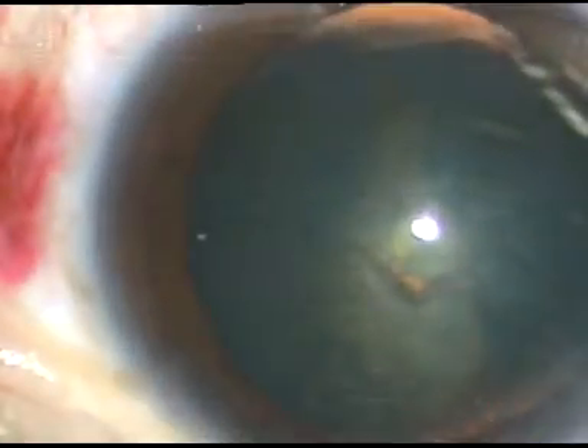Now this is a very important step: hydrodissection. If we inject a lot of fluid, the entire thing will come into the anterior chamber, but I don't want that. I'll inject a little bit of fluid, and as the fluid wave goes towards the opposite side and near the equator, I'll stop. So a little bit of fluid is injected just to separate the nucleus from the posterior capsule.